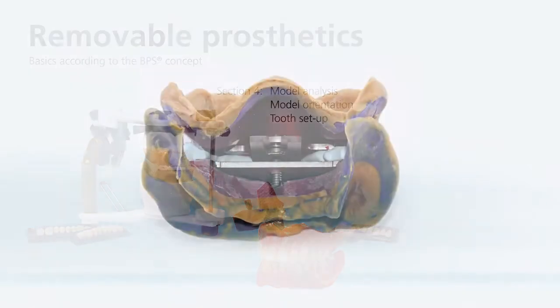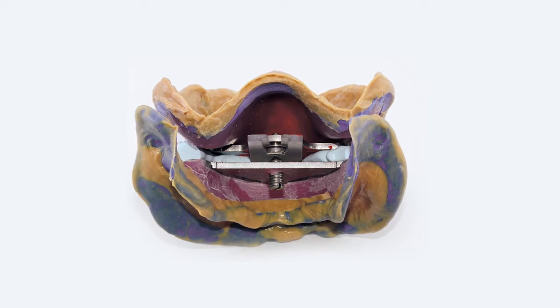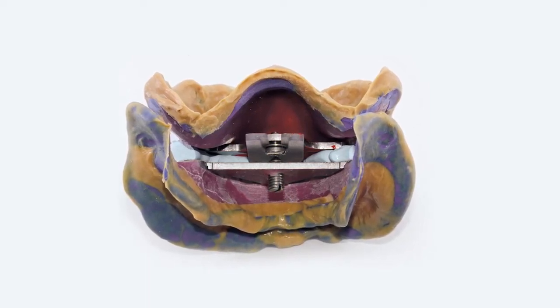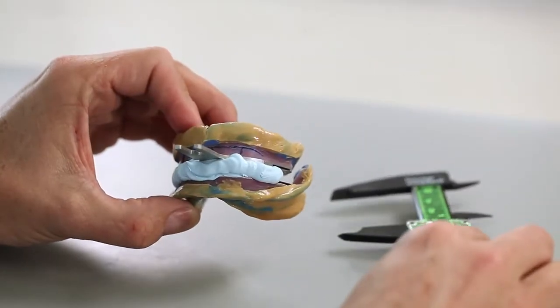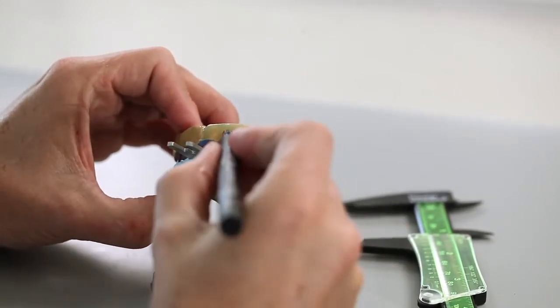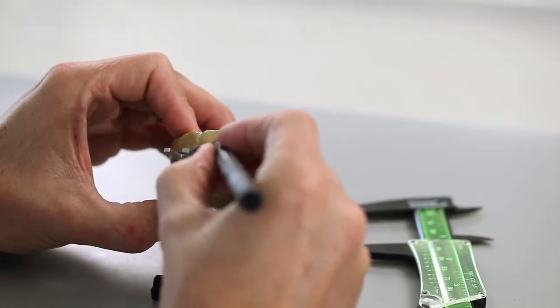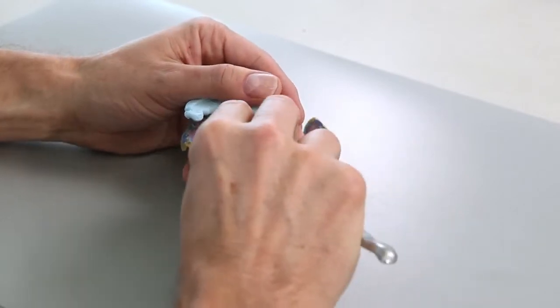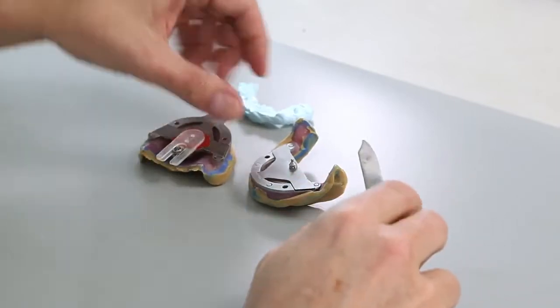The dental technician receives 2 functional impressions which are secured in the correct occlusal height and centric position by means of the intraoral registration of the gnathometer M. Measure the patient-specific intervestibular distance in the anterior region and note it down. After that, carefully separate the functional impressions and carefully remove the support pin registration plate.